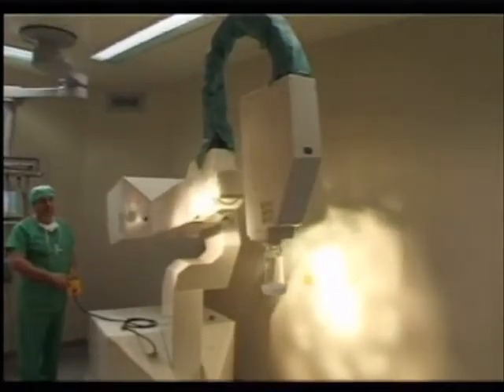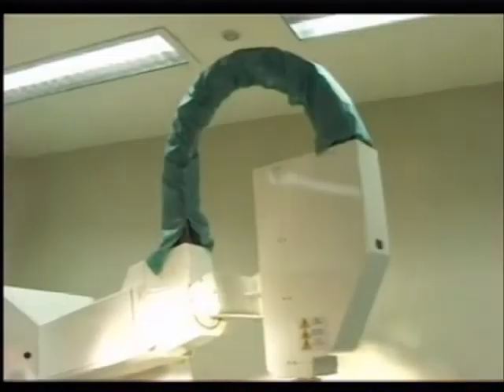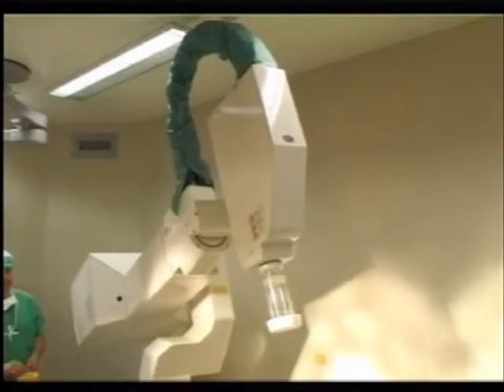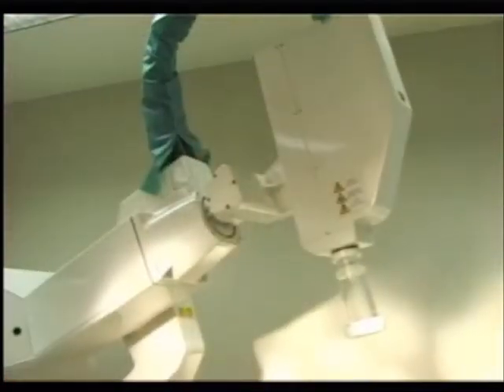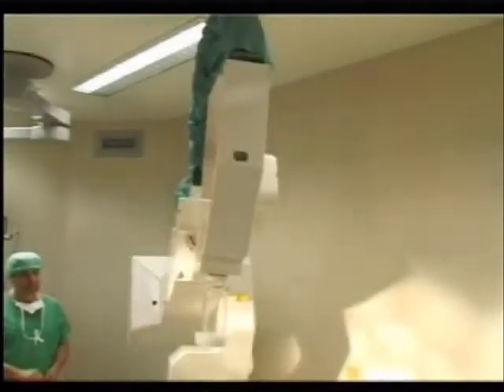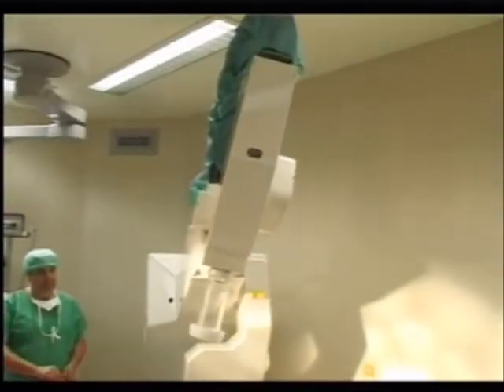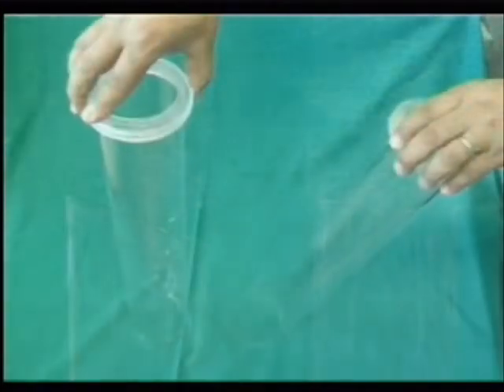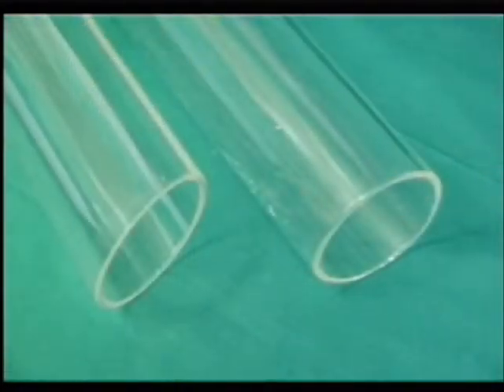The possible movements that can be made with linear accelerator Novac 7 are the azimuth rotation around a vertical axis, shifting on the vertical plane, tilting the radiating head, rotation of the radiating head itself, and finally, it is worth noting that there are both flat and beveled applicators that make it possible to treat any kind of target satisfactorily during surgery.